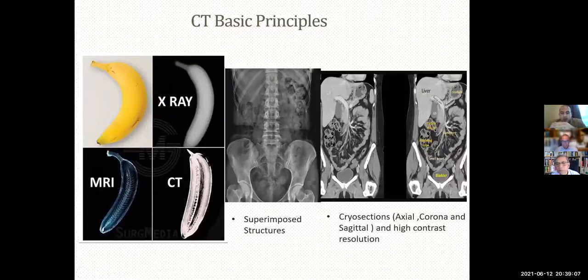So now, any imaging technique depends on getting a difference between different tissues, our objects or our organs inside our bodies. In MRI, you get a difference between tissue characteristics in magnetization properties like T1 constant and T2 constant, as you see here for this banana image.